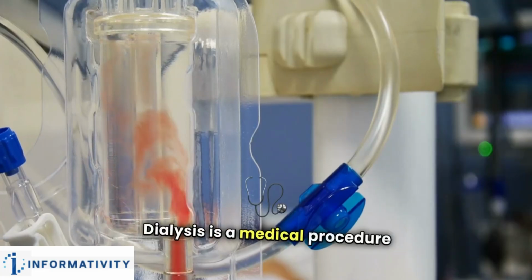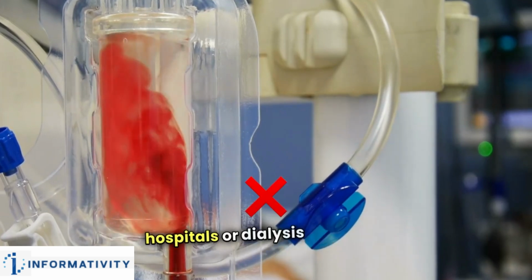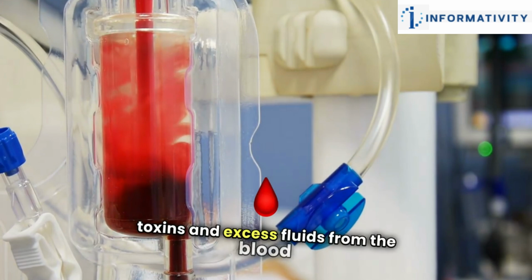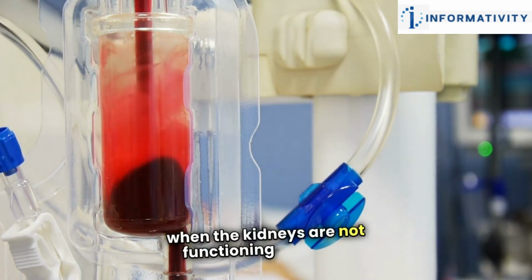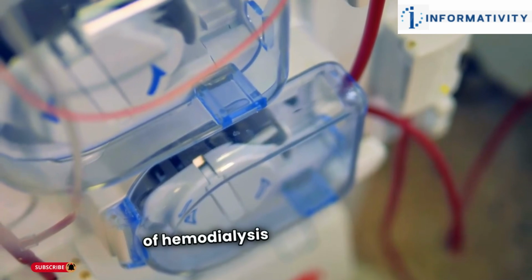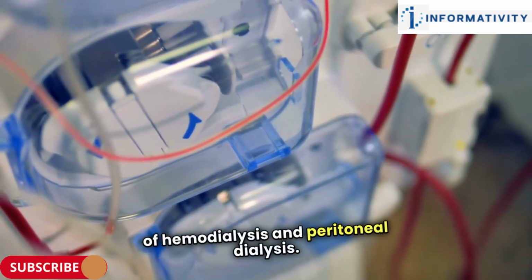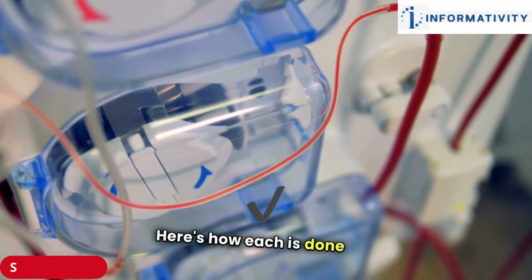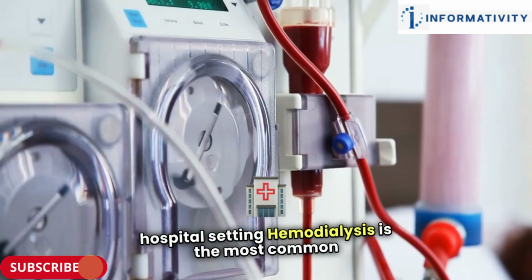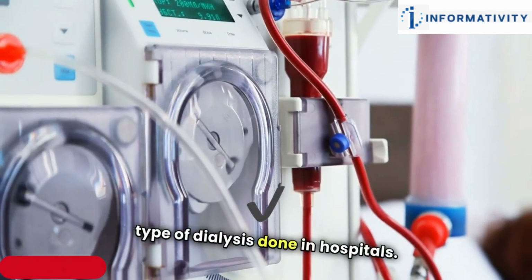Dialysis is a medical procedure performed in hospitals or dialysis centers to remove waste, toxins, and excess fluids from the blood when the kidneys are not functioning properly. There are two main types of dialysis: hemodialysis and peritoneal dialysis. Here's how each is done in a hospital setting.